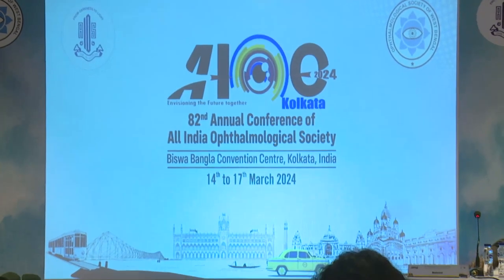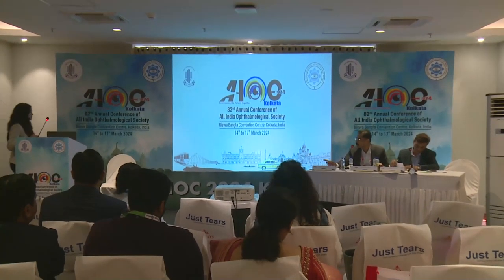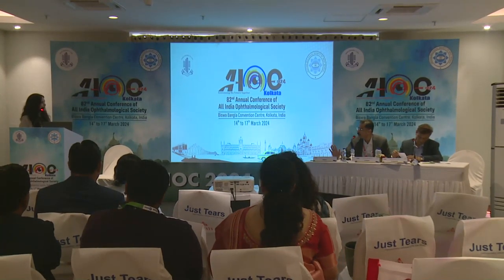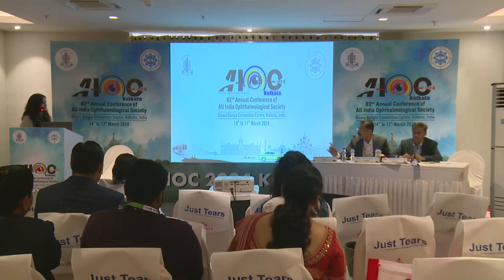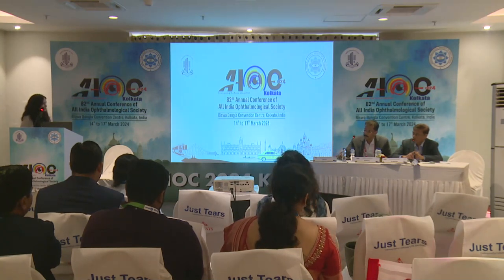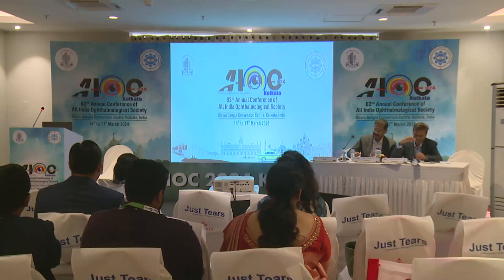Thank you. One second. This is a regular closure of a cyclodialysis cleft. Yes, anything different from a regular established procedure? This is a regular procedure which you used to do on a daily basis. This is how regularly we deal with the cyclodialysis cleft. And also you suggested 10-0 nylon or 9-0 prolene for adequate strength of the closure. Okay, 10-0 nylon. One question.